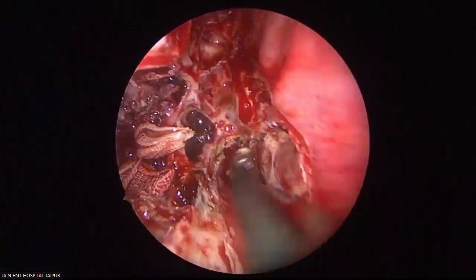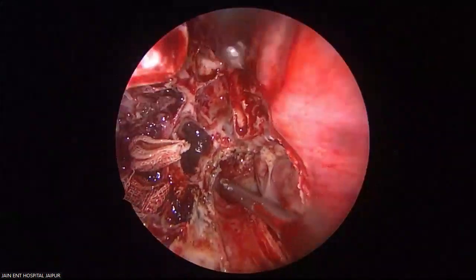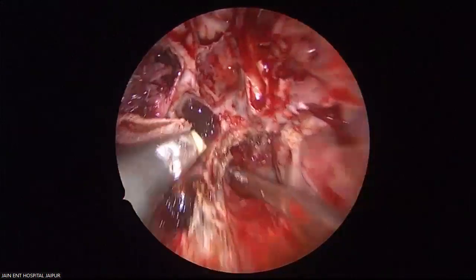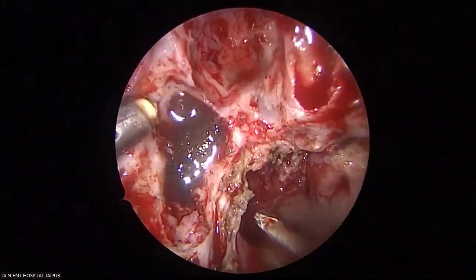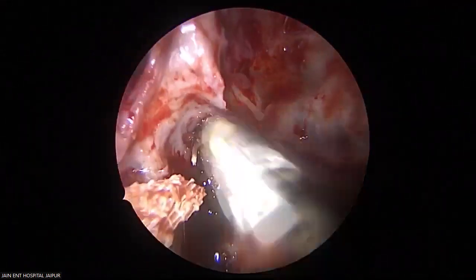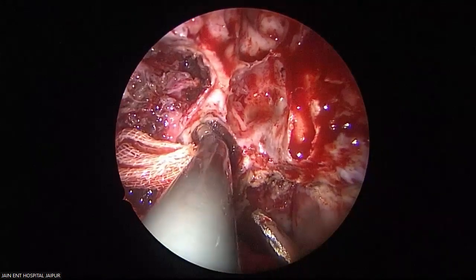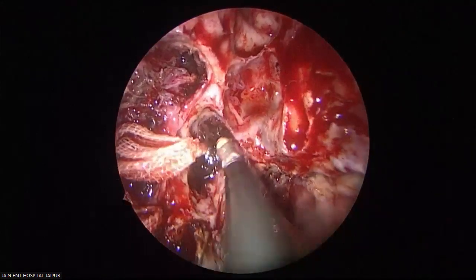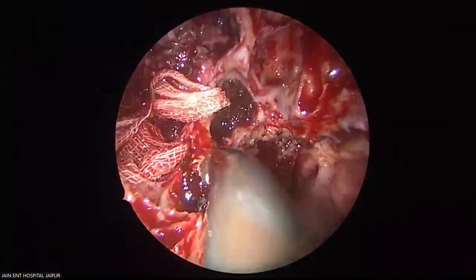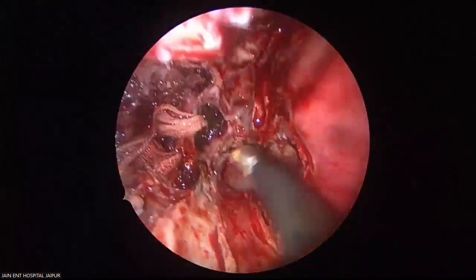See all extensions of the tumor, all the anatomy. See the pterygoid process, see how it is cleared up. Only flat bone all around. See this flat bone? If I drill this flat bone, the temporal lobe is there up. Up there is the temporal lobe. From there only it enters into the middle cranial fossa. Same way you have to pull it. That's it. Excellent.